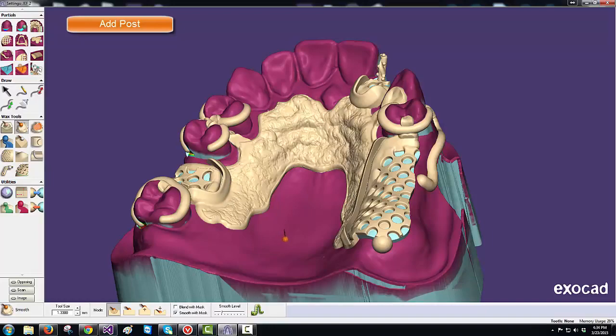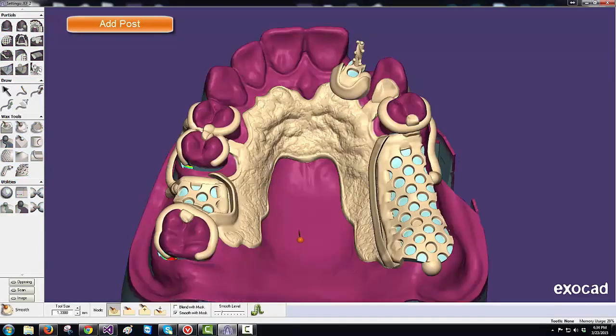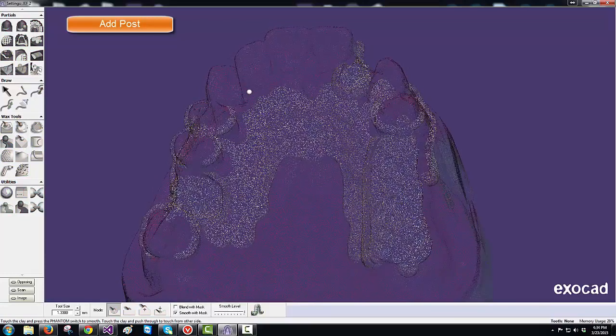In the smooth tool, we have the sub icons. This is melt, turning up the intensity. And we lay down a little bit of wax in the free gingival area to create an apron, but we first turned that to blue blockout.